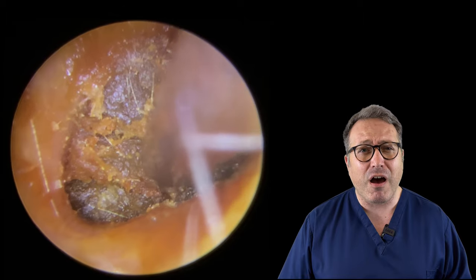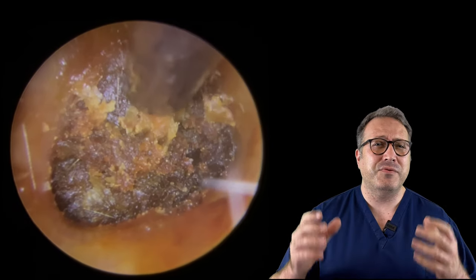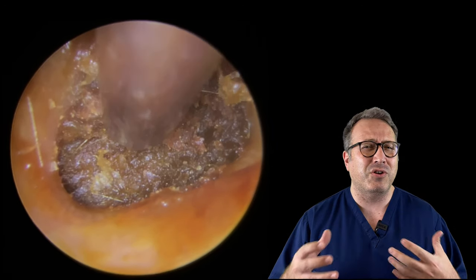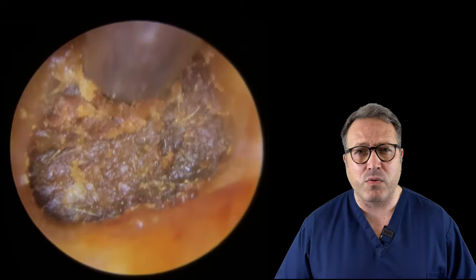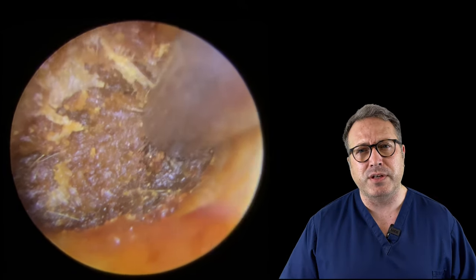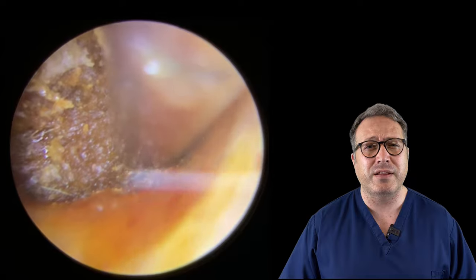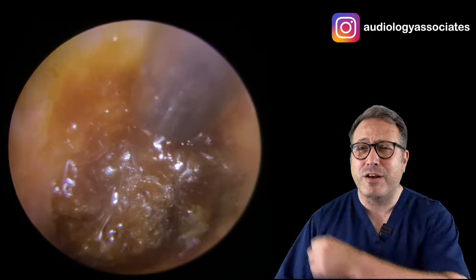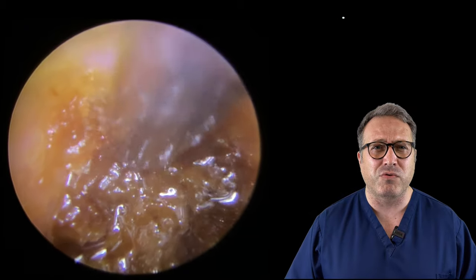You can just see how tough this wax is - it is so solid. As an audiologist doing wax removal, this is the worst possible thing you could see in an ear canal - just so, so hardened up. The patient has really made our job very, very difficult. We thoroughly understand why people do it - with the rolling lockdowns we had here in Wales, it's very difficult to get wax removed. People get really desperate and will try anything to get this out. But as you can see, this is why we say don't put anything smaller than your elbow in your ears.